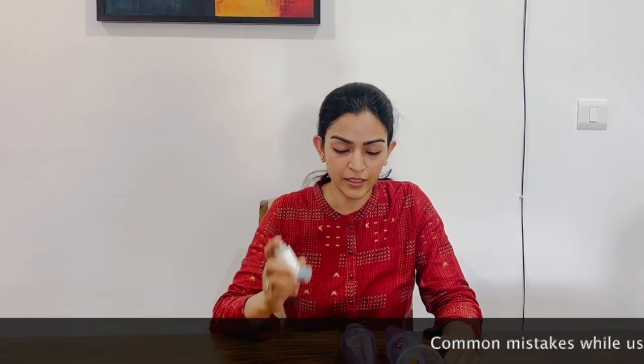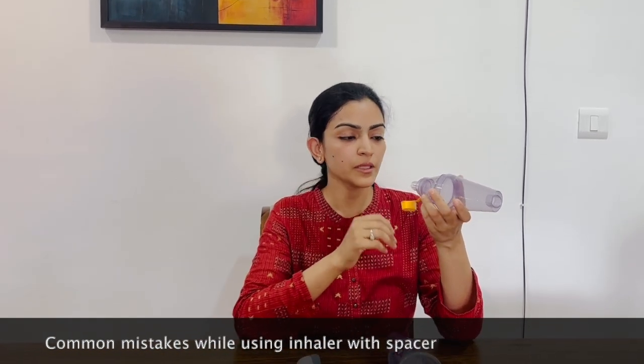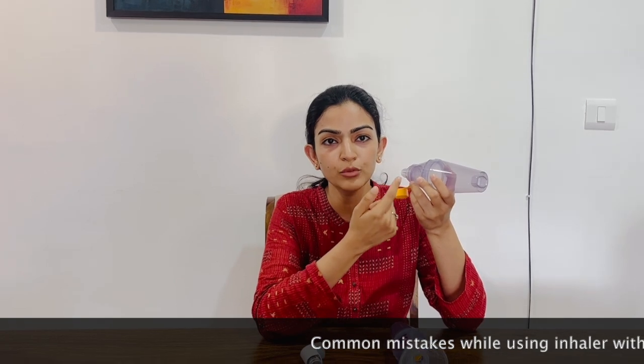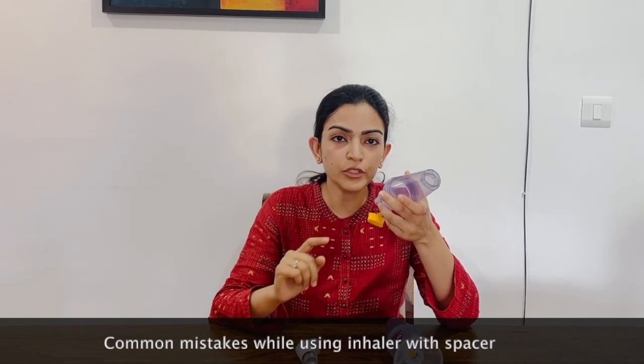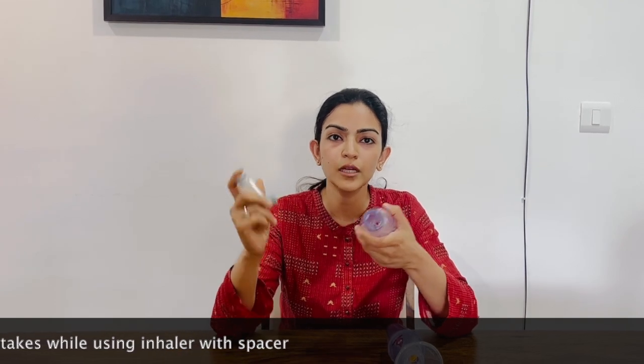The common mistakes that people make are not shaking the inhaler well, and not taking slow deep breaths but taking rapid shallow breaths. So some kids take breaths like this. These breaths are not effective. Slow and deep breaths have to be taken. The third mistake is not creating a proper seal with the lips around the mouthpiece. If a proper seal is not created, the valve will not open and close, so you will not hear the clicking sound. So it is important to hear the clicking sound. And the fourth mistake is not shaking the inhaler again in between the 2 puffs. So the inhaler has to be taken out, shaken well again, and then the steps have to be repeated.